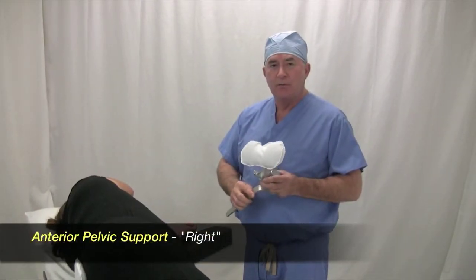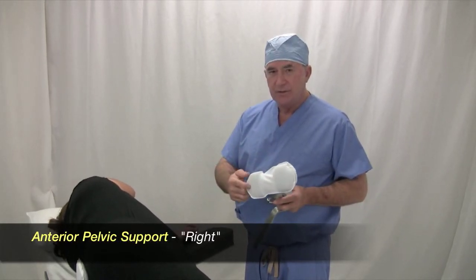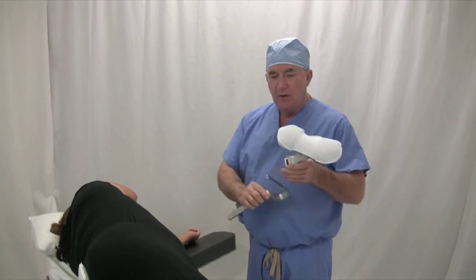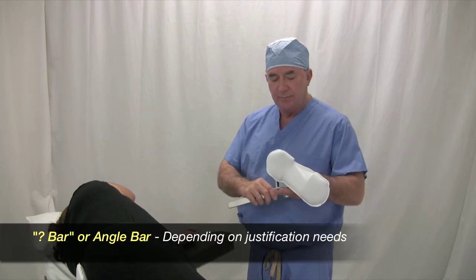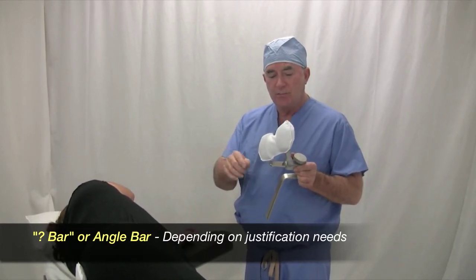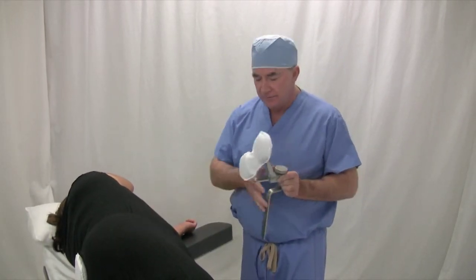The second support that I always place is the anterior pelvis support, at the downside anterior superior spine and symphysis pubis. I'm going to use the angle bar so they have appropriate positioning. Often times it's a regular bar, and in very small patients it's a large bar to support the anterior pelvis.